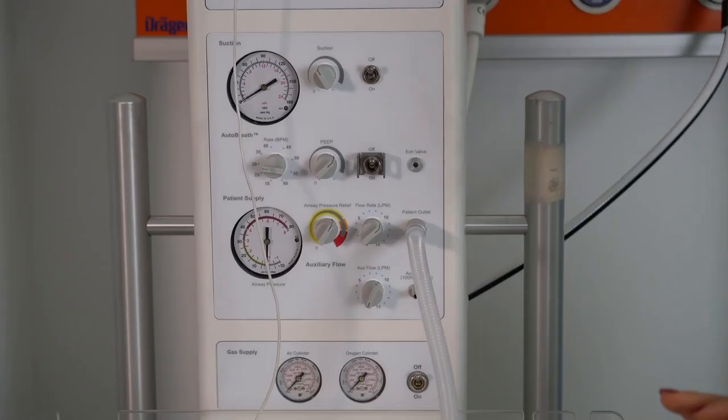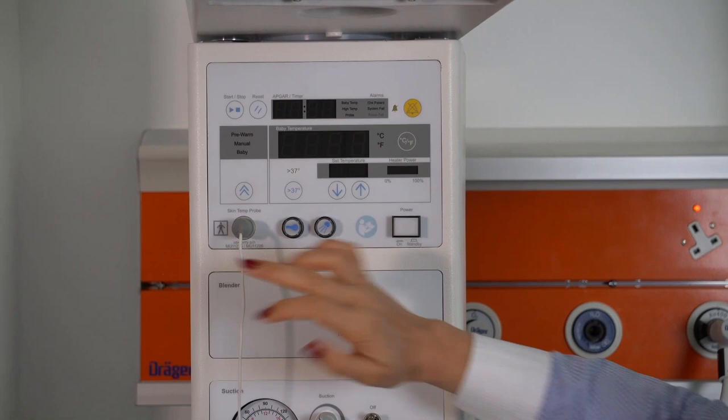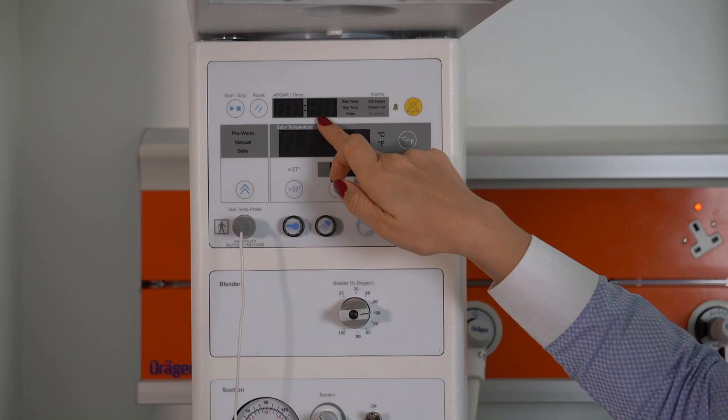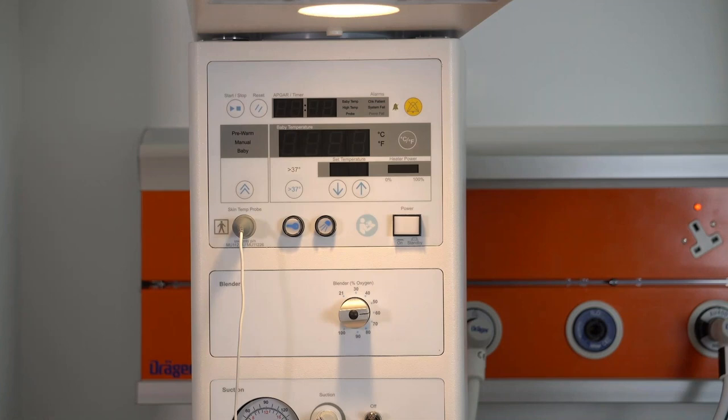So basically, if we look at the navigation screen, we have the main control where we can set up the temperature settings and the settings for the heating output of the radiant warmer. We also have the possibility to activate the APGAR timer, and we have some of the alarms and alarm silencer button. So we have the possibility to turn on the observation light to have better visibility of the baby.